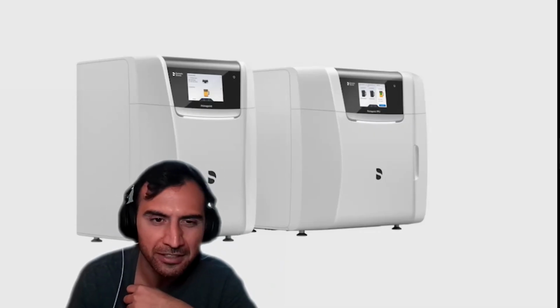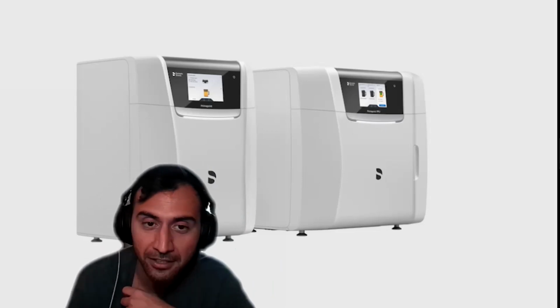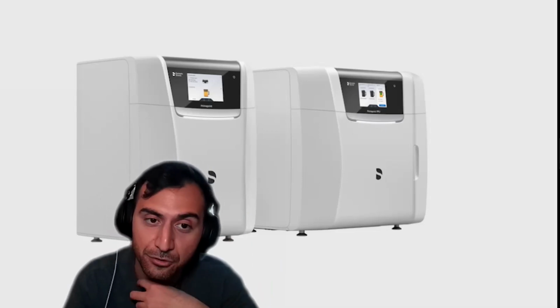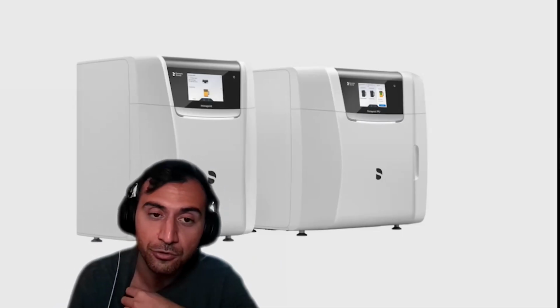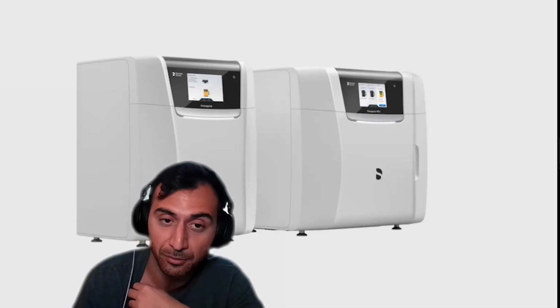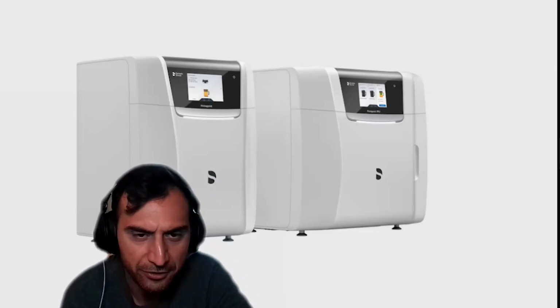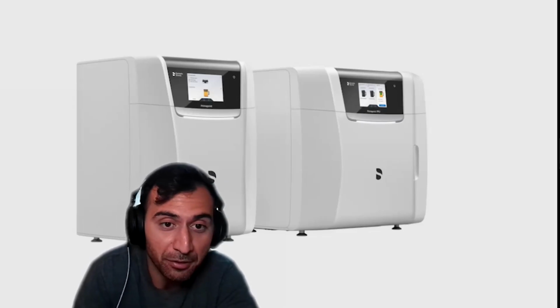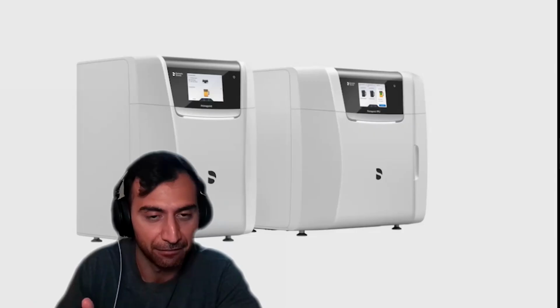But I'll tell you, most systems now have set it up where you can go directly from scanner to printer, even if it's not what I'd consider a dental printer. Like I know SprintRay, you can do that from a Trio scanner. You can pretty much send it directly to your SprintRay and get it to print right away. That's the whole concept that I believe Dentsply was trying to do, is create this for dental office purposes, rather than what we've been looking at, which are 3D printers that have existed for other purposes that we've repurposed for dentistry.